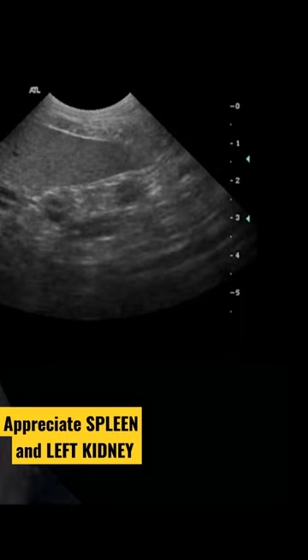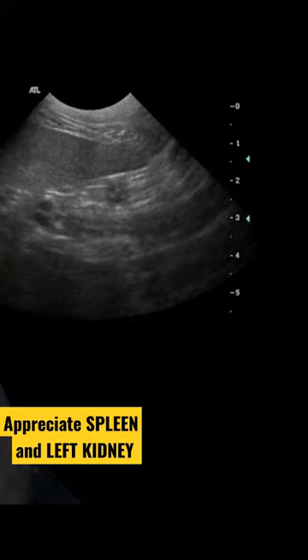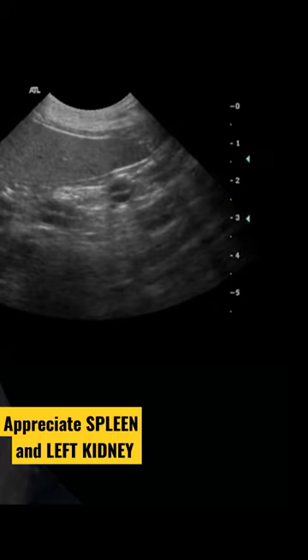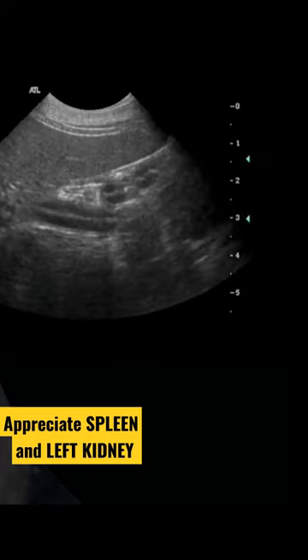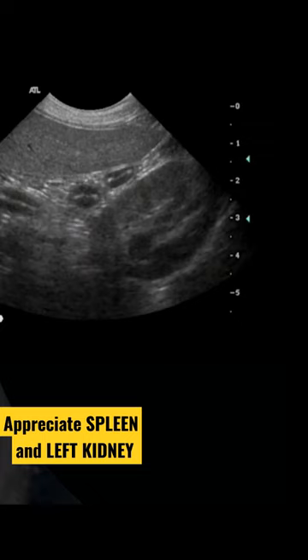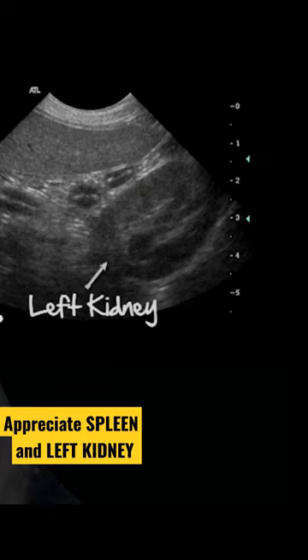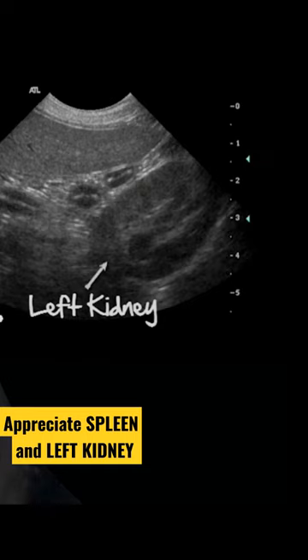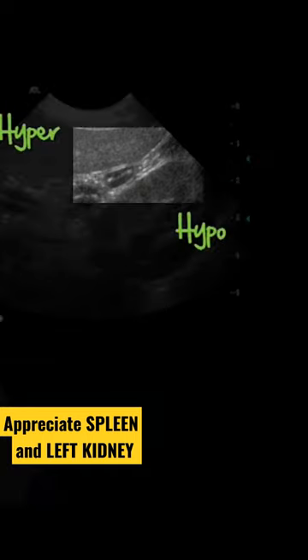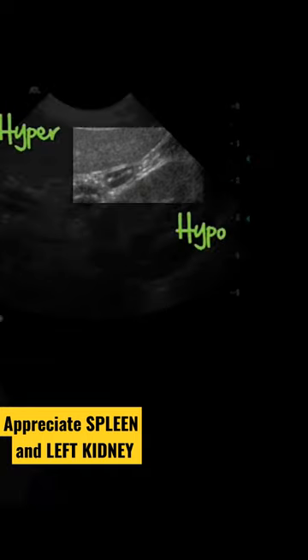The examination of the spleen is completed caudally and ventrally, covering the rest of the body and tail of the spleen using variable imaging planes. While examining the body of the spleen, the kidney is visualized just dorsally, allowing comparison of respective echogenicity.